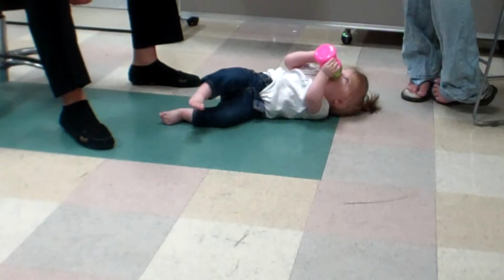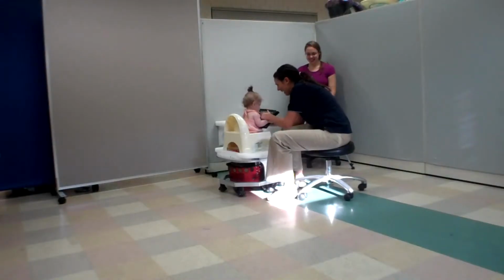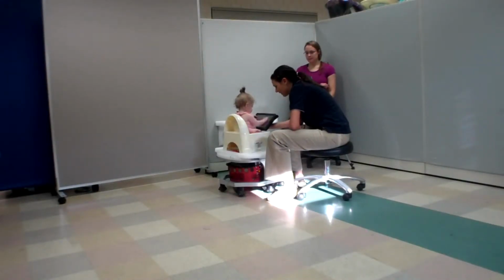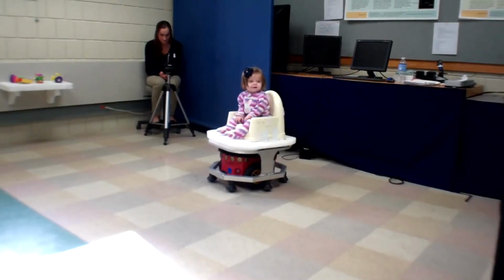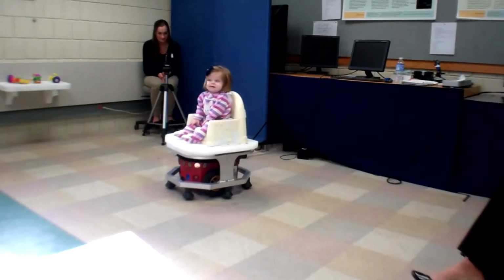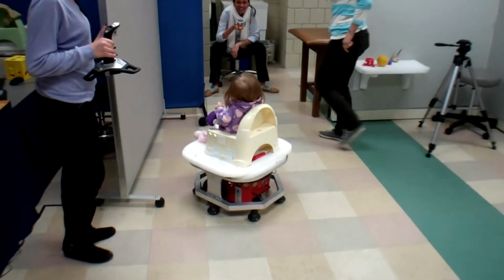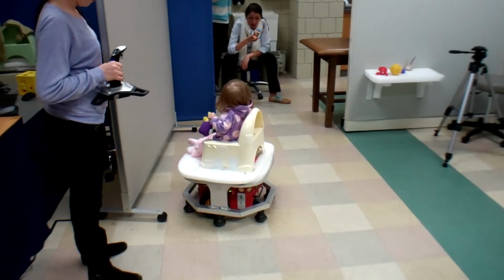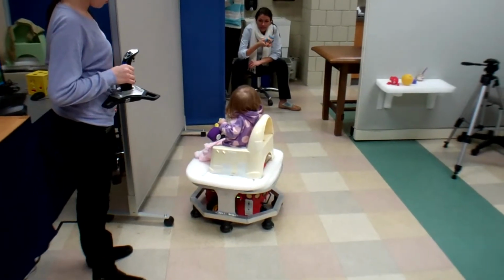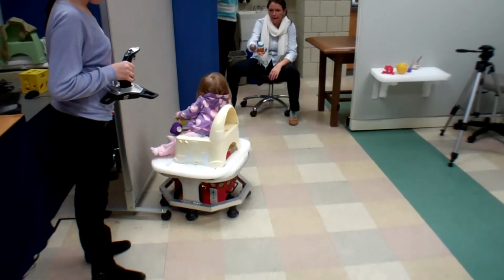Good stuff. She is with Jaylee, and then Jaylee leans, and when Helen judges she's lost balance, she'll say, yeah. Using the Wii board, whenever she wanted to go somewhere, she had to move her trunk, with control, which is one of the things she was having difficulty with. It made sitting so hard for her. So we think that just by making the robot go, by leaning her body, by trying to move the robot to where she wanted to go, she was inadvertently kind of giving herself physical therapy.